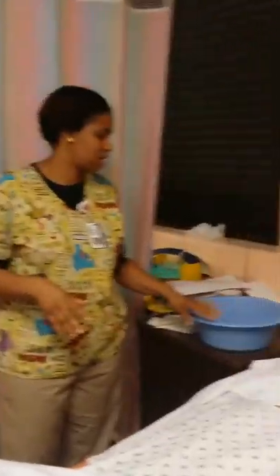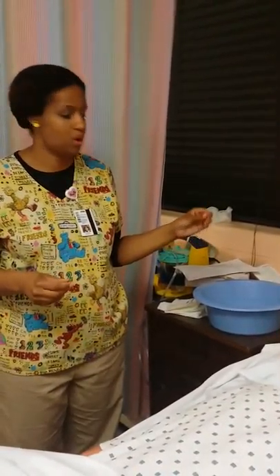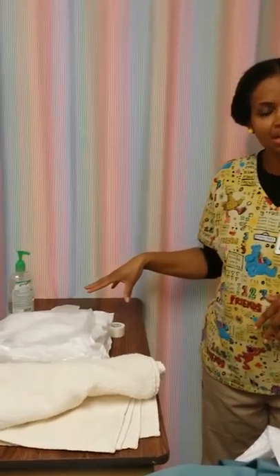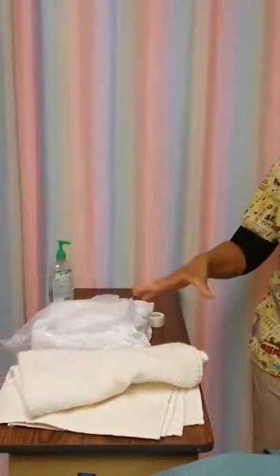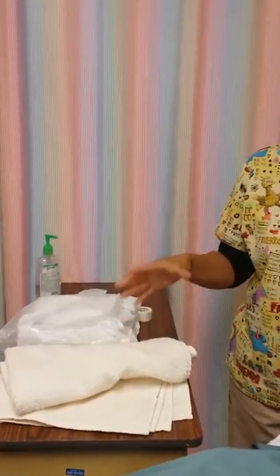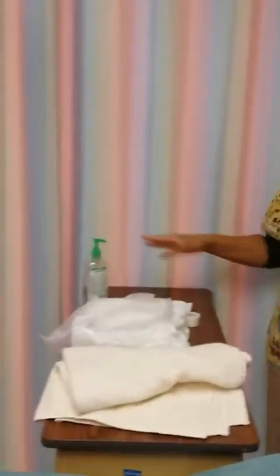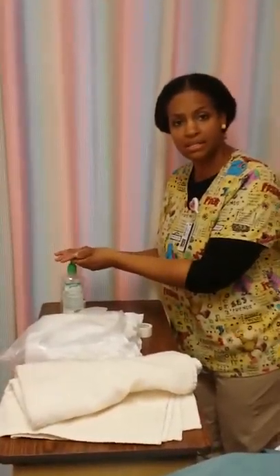I have my basin with warm soapy water and a towel so I can clean the meatus. And I have just some regular clean gloves. I have my sterile catheter kit. I have a towel to cover the patient for privacy. And then I have my hand sanitizer and tape to secure the catheter. So first thing I'm going to do, I'm going to clean my hands.